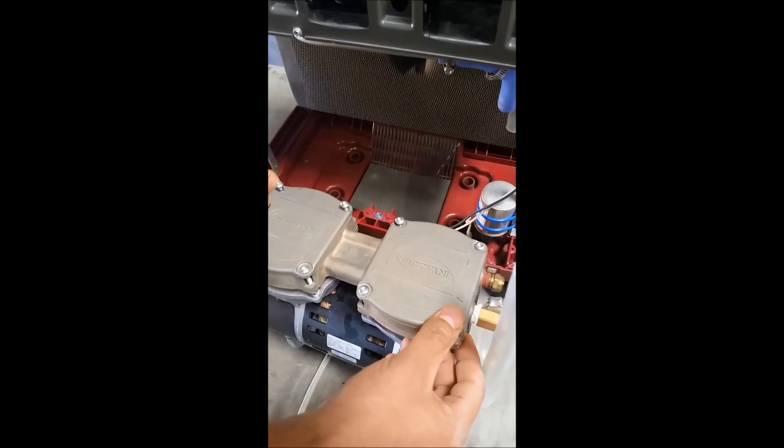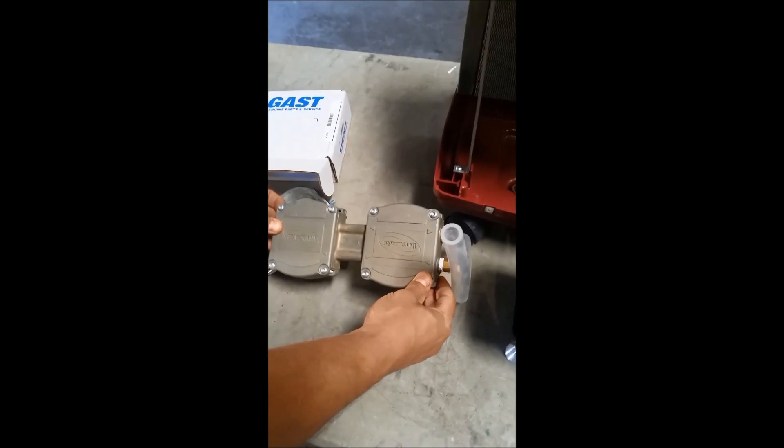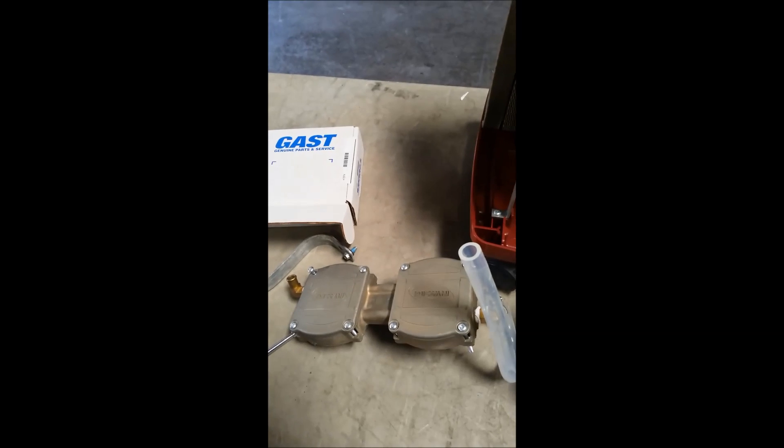Now that the screws are loosened, we're going to remove the top and keep it facing the direction that it was unscrewed from. This way you don't switch it around — it's very poor for the rebuild.